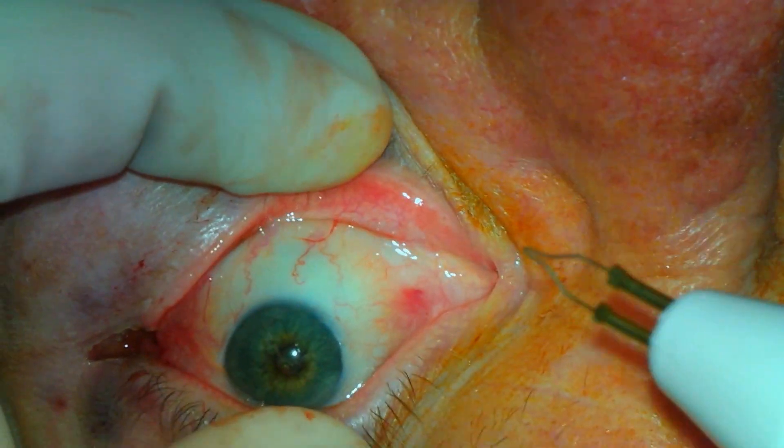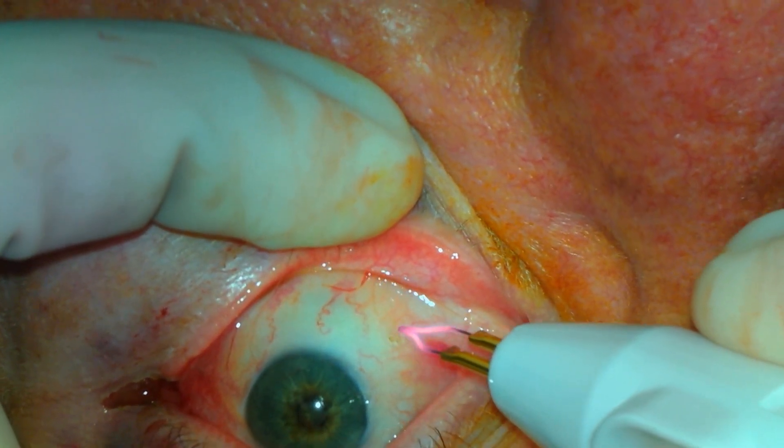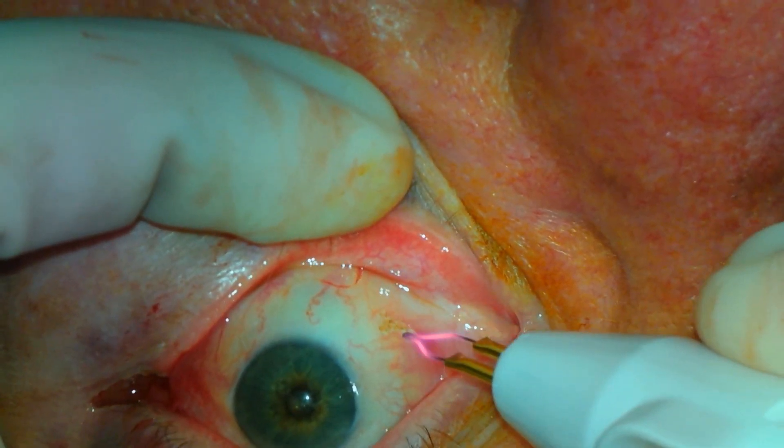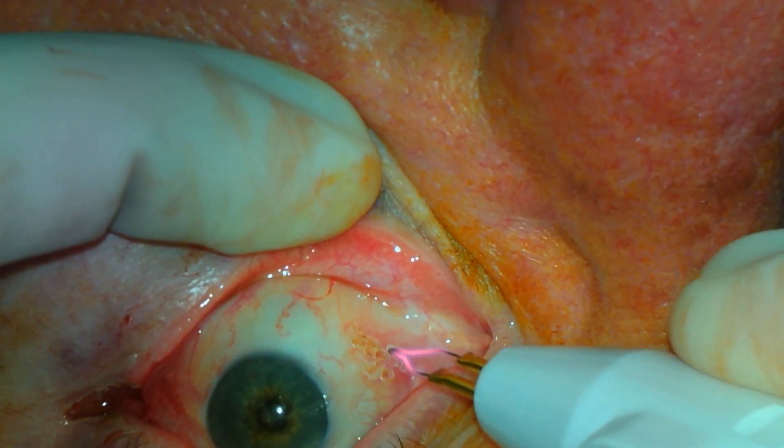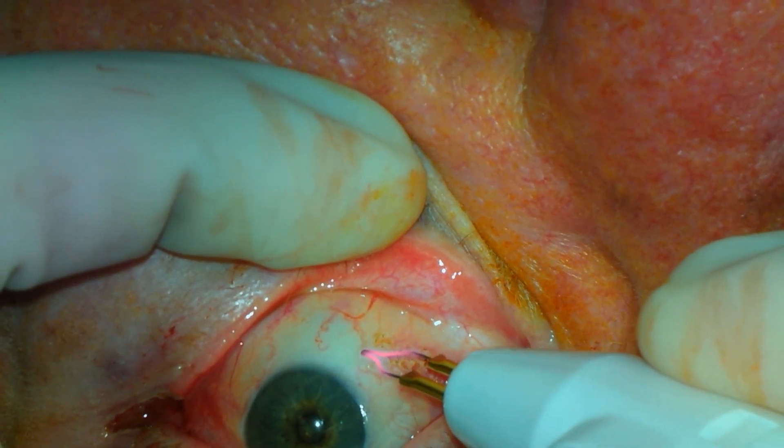The diffuse cauterization seems to be less prone to focal areas of irritation after the surgery. As this site is not as significant, less cautery will be applied. At the borders of the treatment area, the application is feathered out.